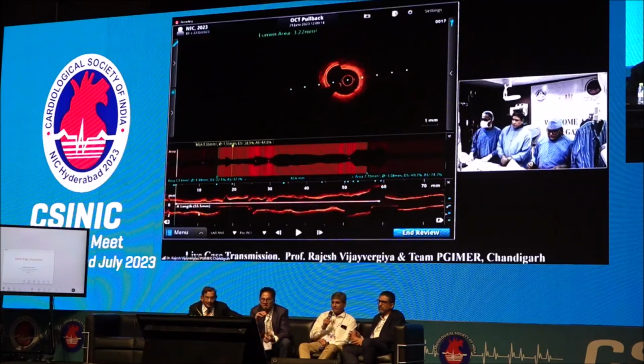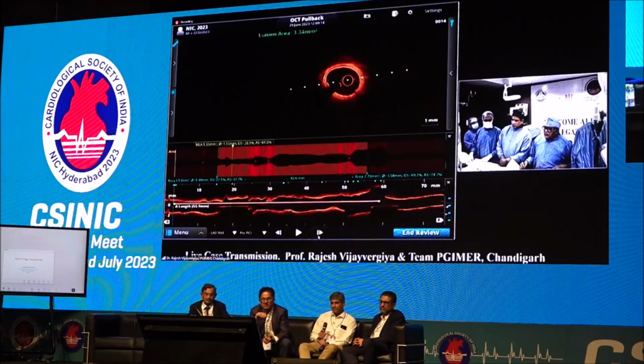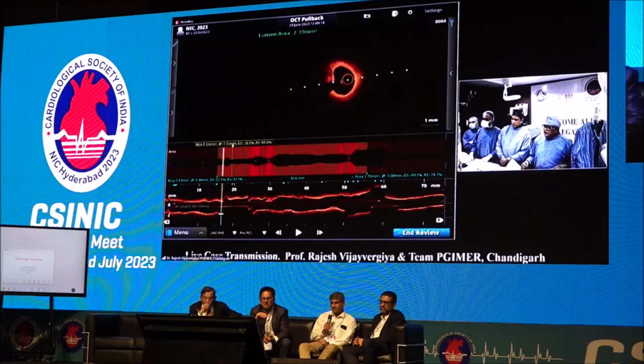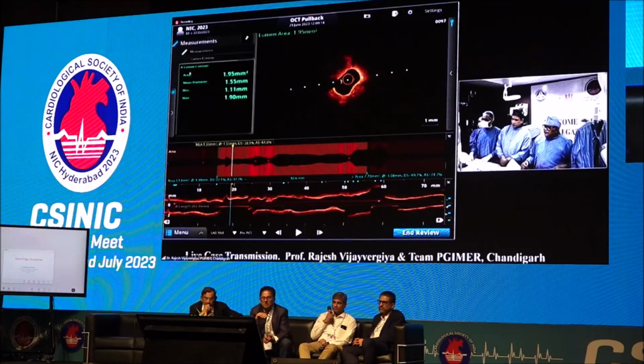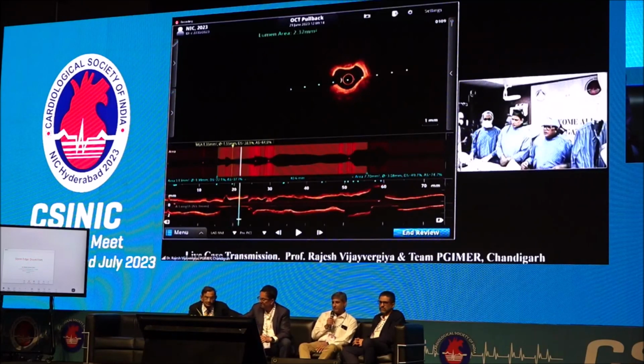55. The mid LAD MLA is what? Can you show the minimal 1.95? Okay, very significant. By the definition criteria, I think, will it fit into an upfront two stent strategy?